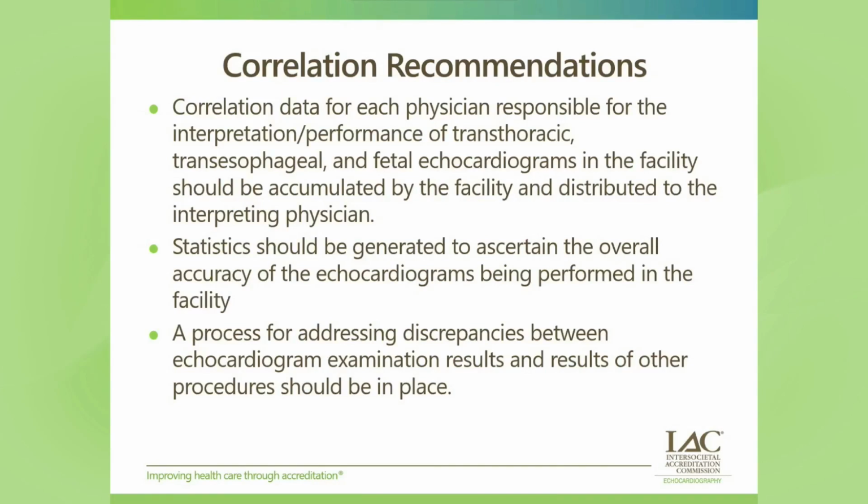So if you hold those statistics and you map them over time, you should be able to see improvement as you've been making changes. And any process for addressing discrepancies between the echo exam results and results of other procedures should be in place.